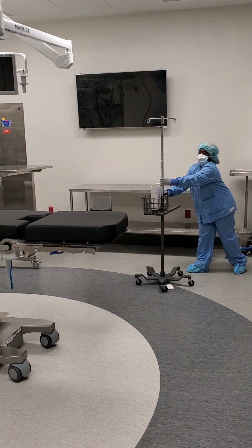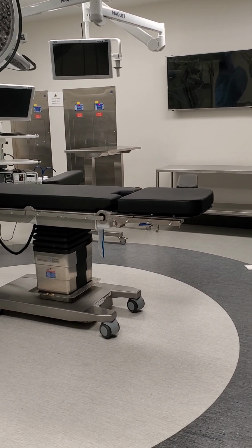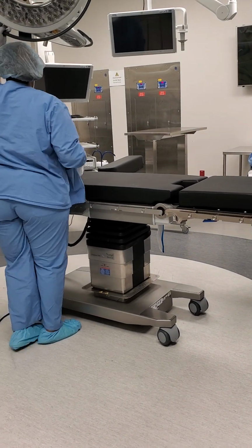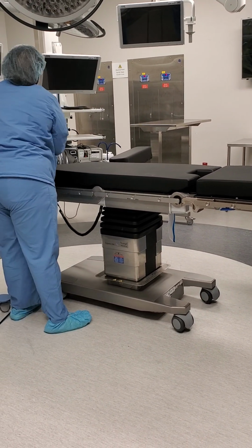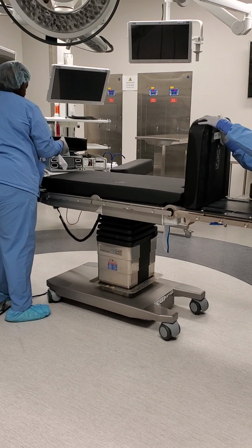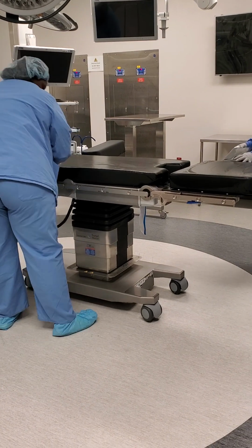We always, once again, want to make sure to clean from the top of the room and then from the outside of the room to the inside of the room. Once all the outer areas have been cleaned, the last area that we will focus on will be the bed. We want to make sure to clean all of the cushions on both sides and the hard top of the bed. We also want to clean the arm boards, removing the cushions and cleaning both sides and the arm board itself.